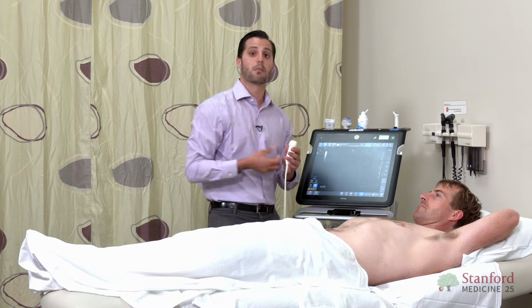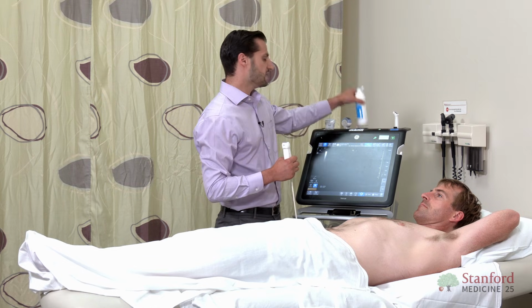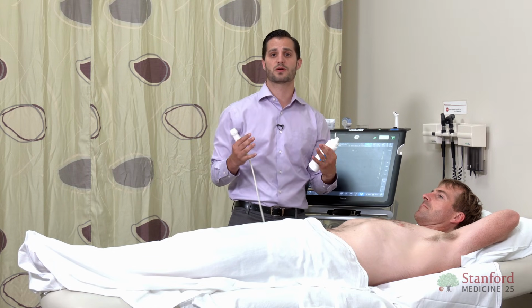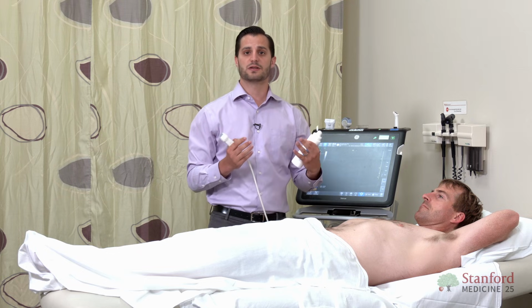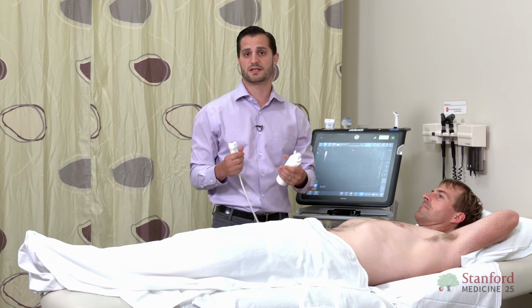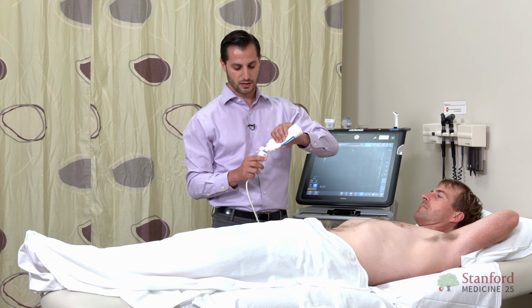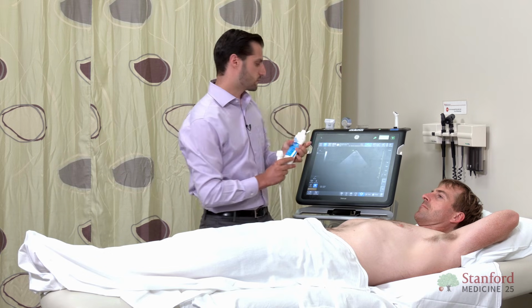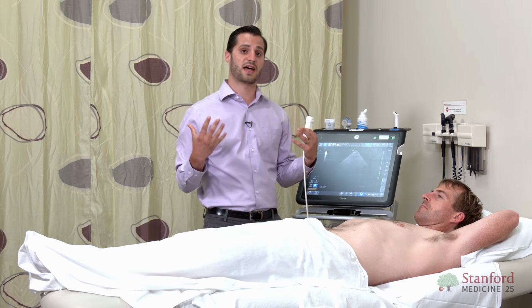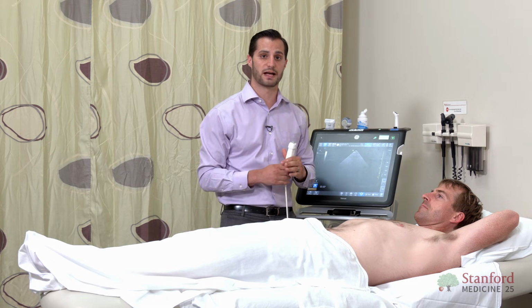Now let's discuss bladder. When thinking about bladder ultrasound, this can be quite helpful in patients on the hospital ward who are elderly, confused, and you need to assess if they have urinary retention as a potential cause for their altered mental status. There are several measurements that you can take at the bedside to assess if they have substantial volume within their bladder.